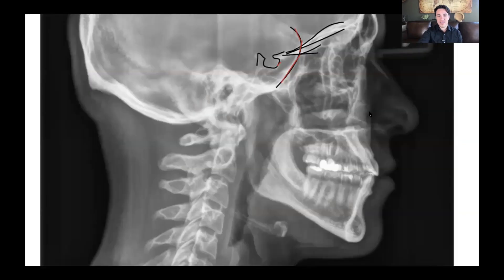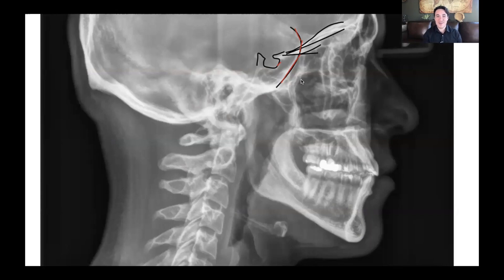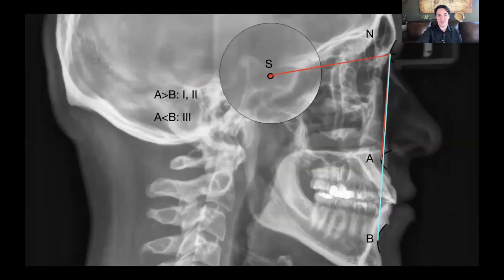The red structures here are the stable cranial-based structures that we use in order to superimpose. When you're tracing these, they're not really helping you look at the snapshot angles or the clues — it's really only for superimposition, which offers its own clues.